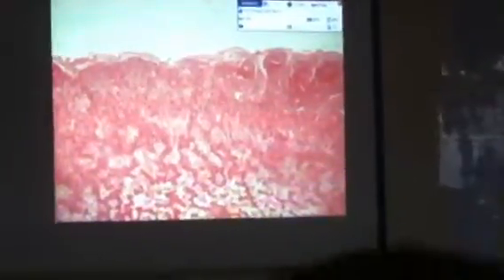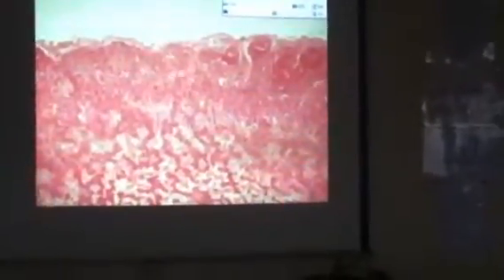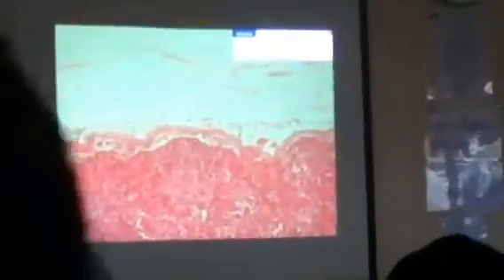There are a lot of spaces present in the medulla. Thus, the soft consistency of the medulla compared to the cortex, which is filled with cells. Those pointed cells are actually the lymphocytes, and those are the nuclei of the lymphocytes. Now, we will begin the characterization of the components of the cortex.